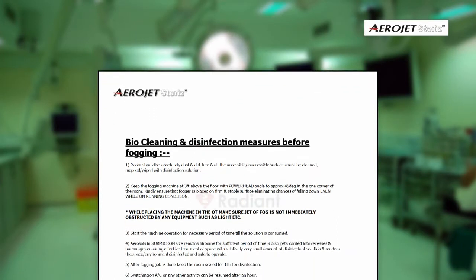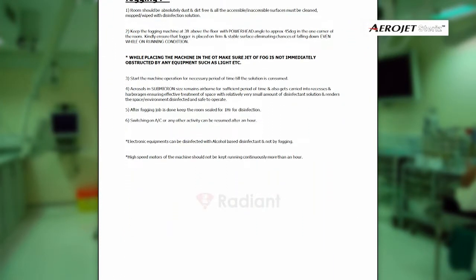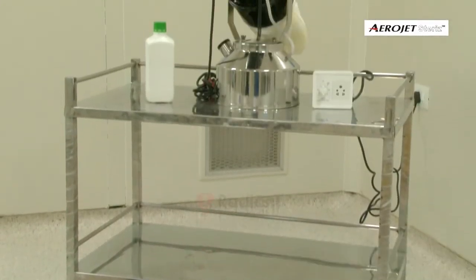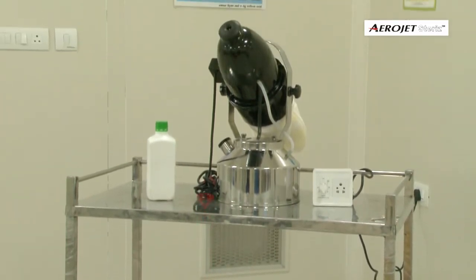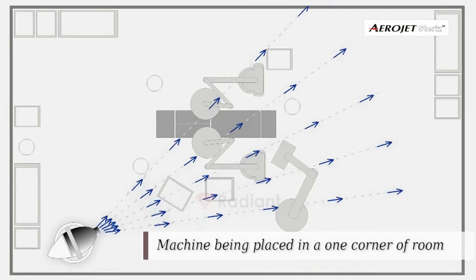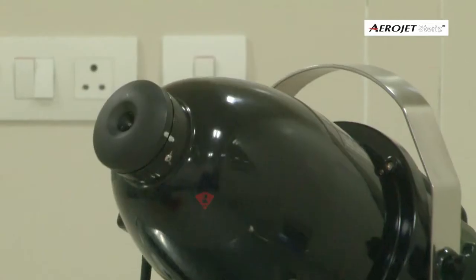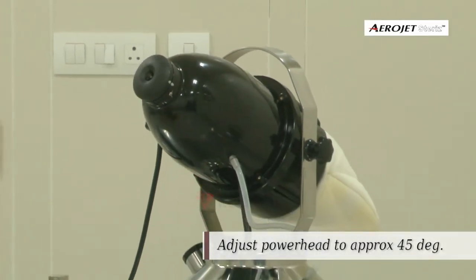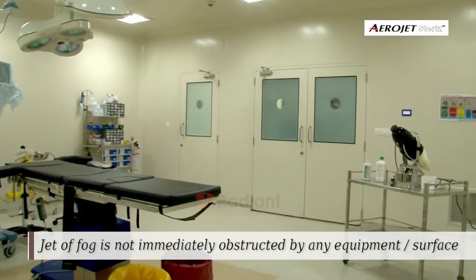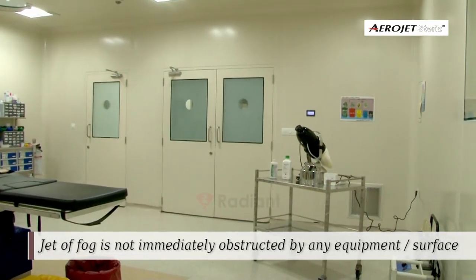Strictly follow the airborne disinfection protocol sheet provided with the operating manual, which clearly mentions preparation of disinfectant solution and duration of fogging treatment. Place the fogging system on a steady surface at three feet height such that there are no chances of it falling even while running. Adjust the power head to approximately 45 degrees into the room, making sure the jet of fog is not immediately obstructed by any equipment or surface.